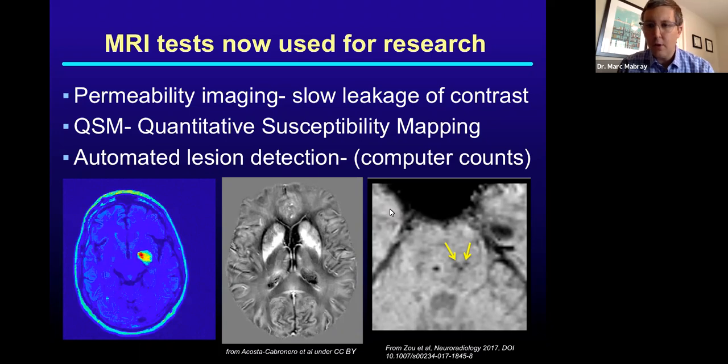As many of you know, particularly familial CCM patients can have many, many hundreds of lesions. And when you have a lot of lesions, it's very, very difficult to count. Some of them are very, very tiny, sub-millimeter little dark spots, and very tedious.